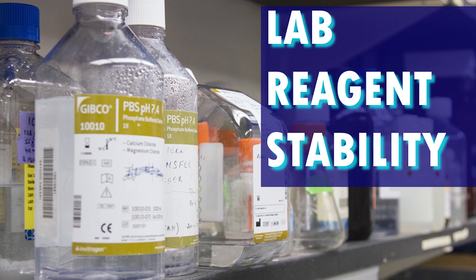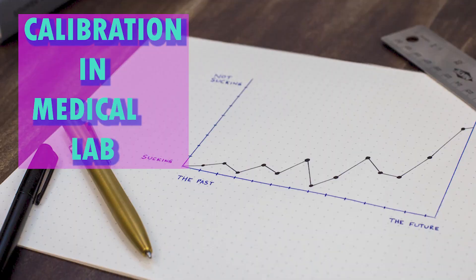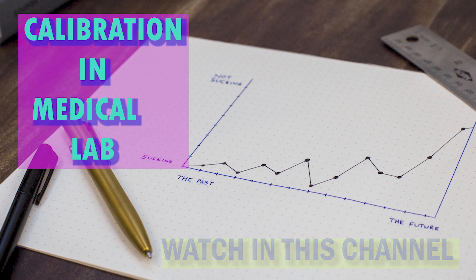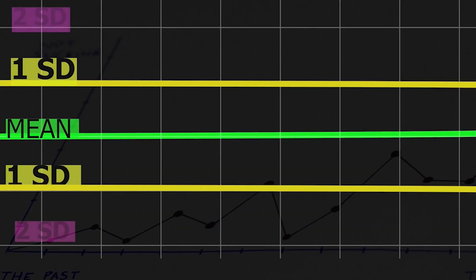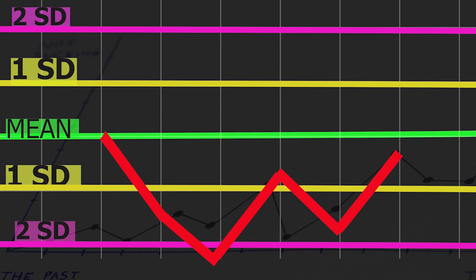Calibration: the calibration of an analyte is an important factor in getting good QC results and test results. Please watch the calibration in the medical lab video on this channel to understand better. Make a list of analytes to be calibrated before running a QC: new reagents, stability-expired calibrations, and new lot numbers of reagents must be calibrated. Check the previous QC graph of each analyte and each QC level, and make a decision to calibrate. Check the previous QC run of all three levels and make a list of analytes that need to be calibrated again.